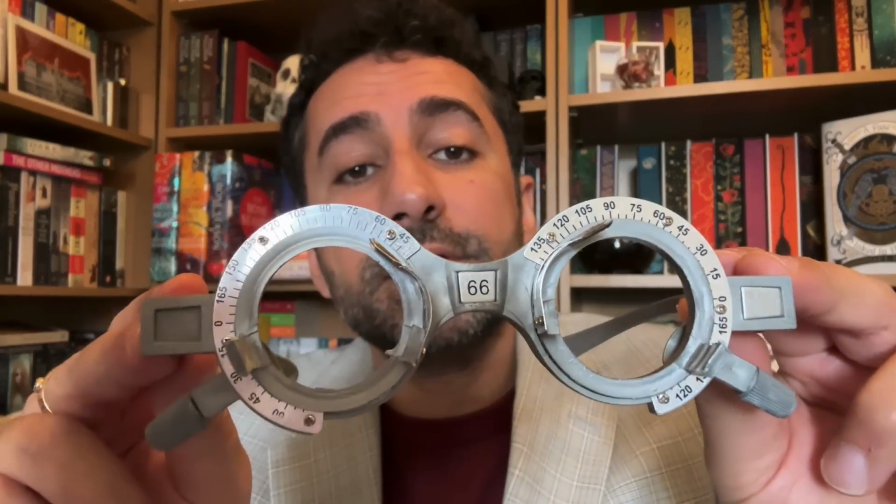Right. We have this device which we place onto the patient when checking prescriptions. It holds the lenses front and back, and we have the rotatable part there. What is this device called, please? What is it called?